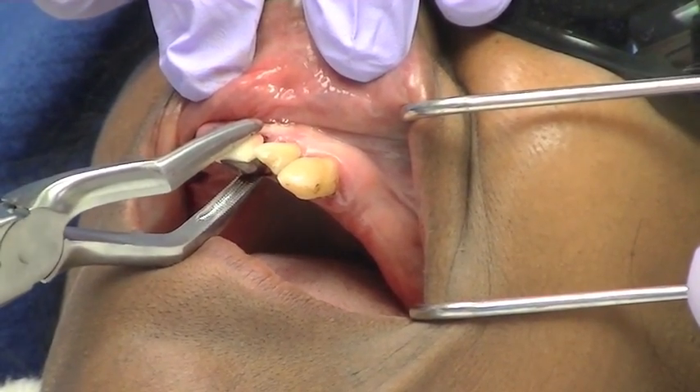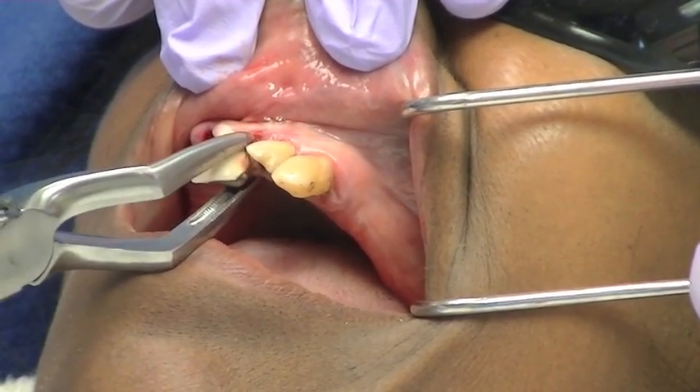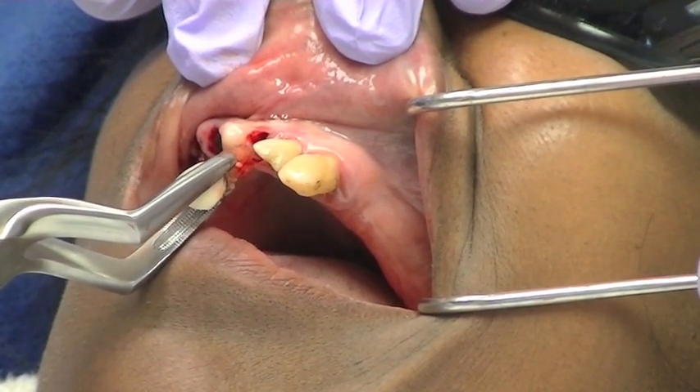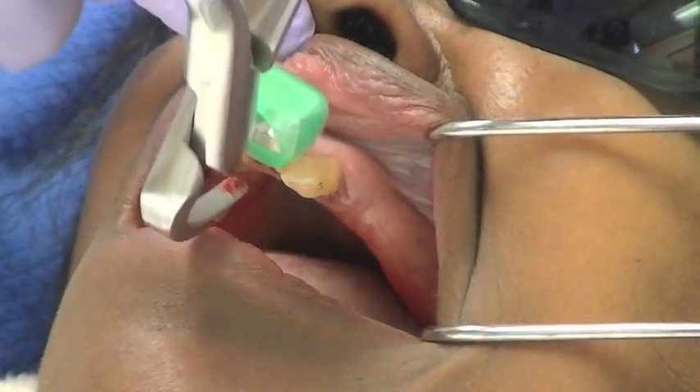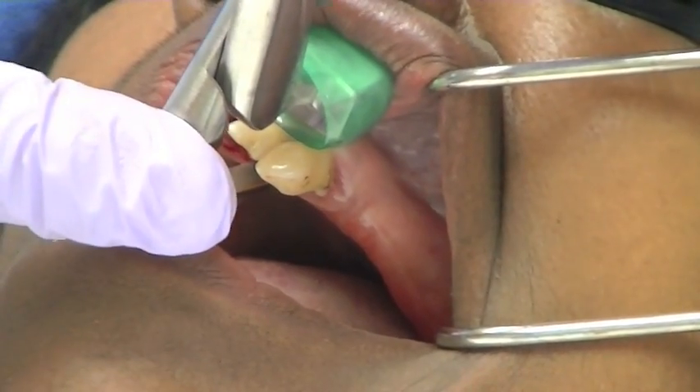Once the instrument is placed, no squeezing pressure is applied to the handles or to the tooth. Instead, the handles are only rotated a few degrees using only wrist movement. You do not want to squeeze the handles — again, this is not a forcep.